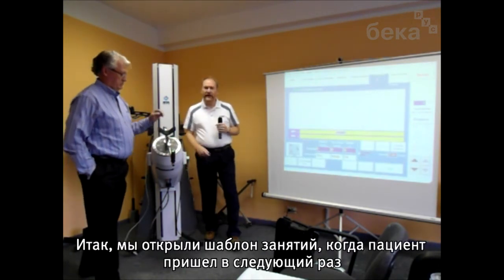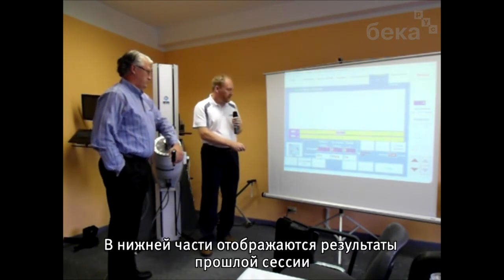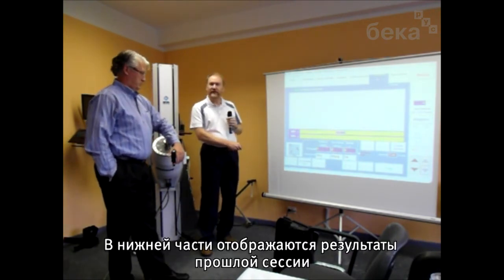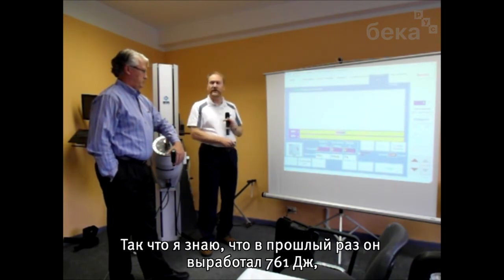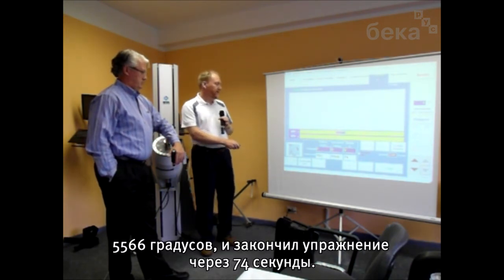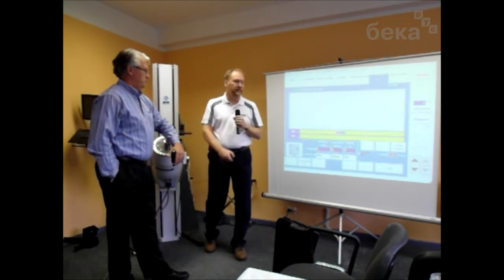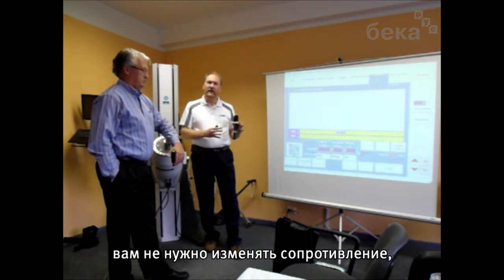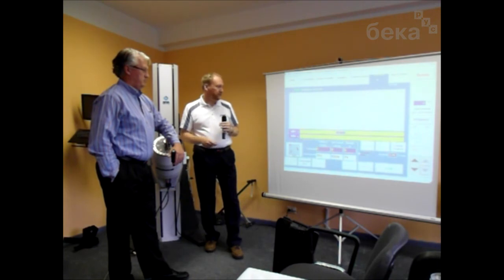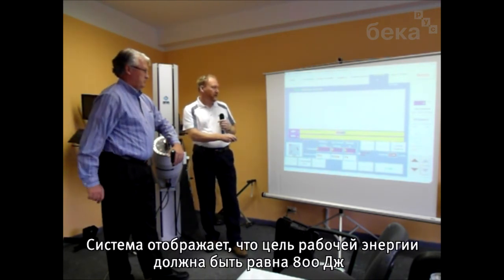So when I bring up the exercise for the next time the person comes in, at the bottom it's going to show you the results of the previous session. So here it shows the last time he was here, he did 761 joules of work, 55, 66 degrees, any exercise for 74 seconds. It automatically set the resistance the same as it was last time, so you don't have to do any changing of the resistance. You can just keep working at the same level. And now it's showing us here that the goal is going to be 800.